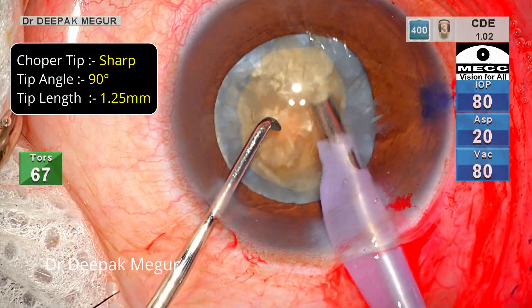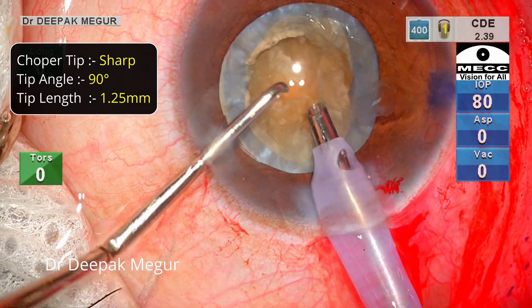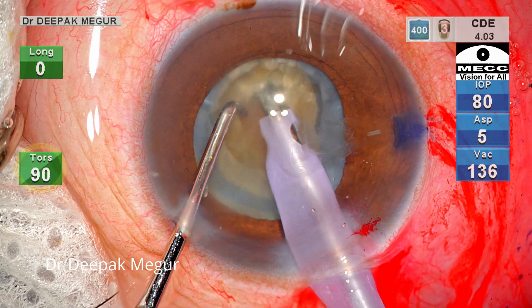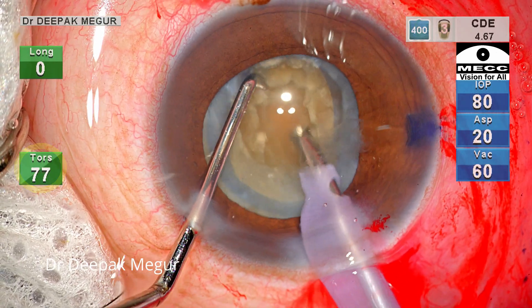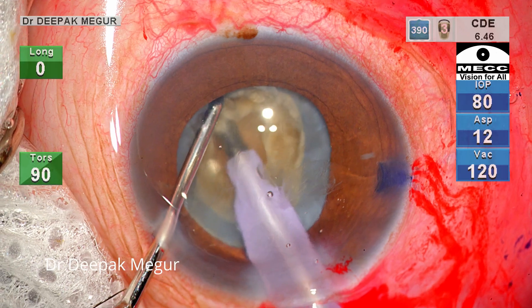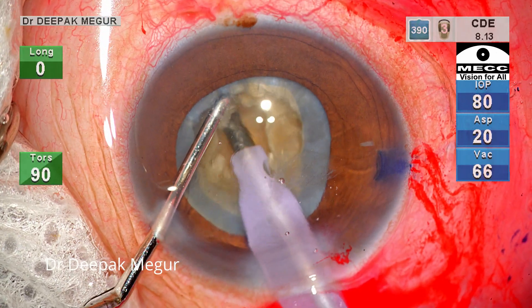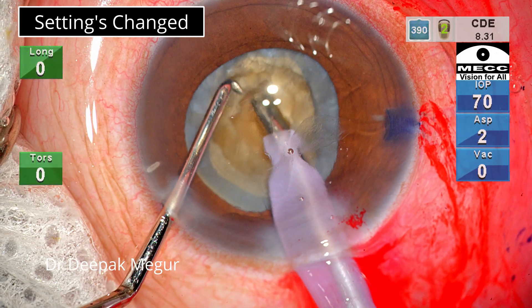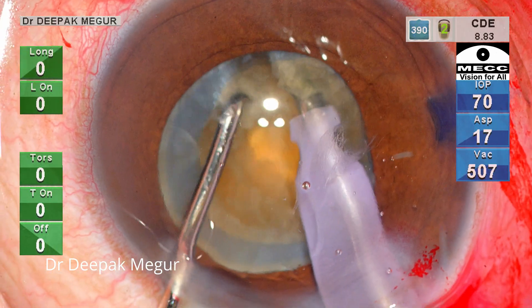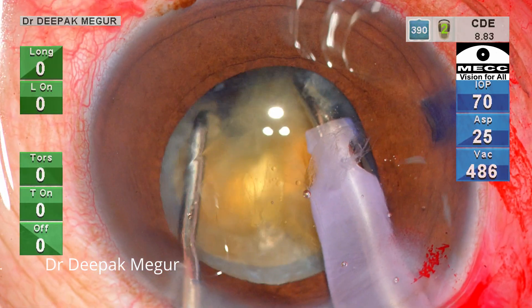The chopper I'm using is a similar sharp chopper with a sharp tip and inside cutting edge, 1.25 mm in depth. The chopper is used to stabilize the nucleus as I do some initial trenching using only torsional ultrasound — 90% ultrasound energy. I'm trying to go in at least 70% depth to get a firm grip on the central core of the nucleus. Settings are changed to longitudinal energy and chopping begins. The nucleus is definitely harder compared to the previous one and one vertical chop is not going to separate it.